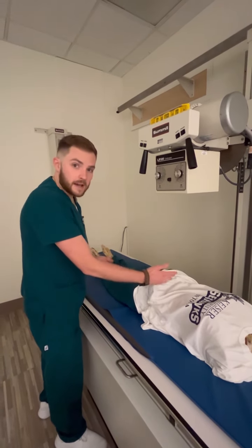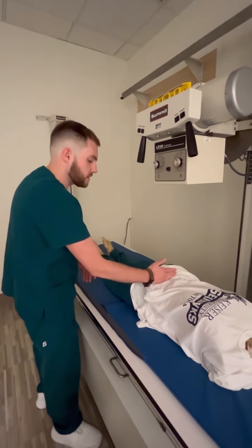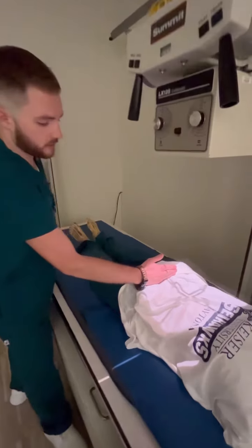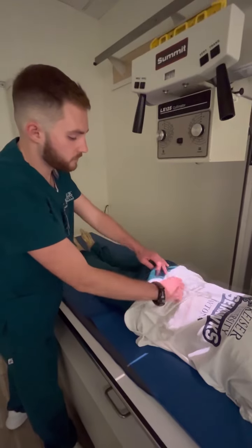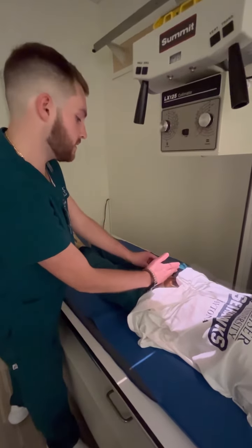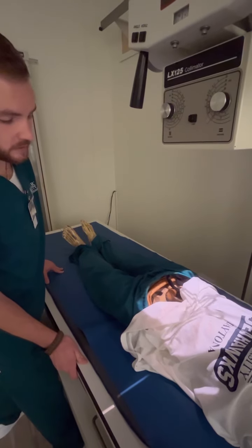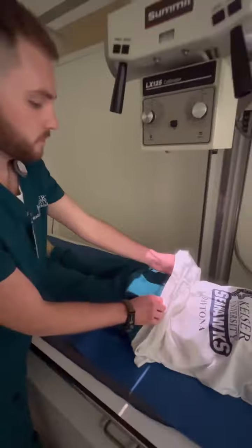Do you need to use the bathroom? Patient will say yes or no. If they say no, I'll just keep on going until I feel hard, which should be about right here, right about there. And Miss Pat is transparent, so I'm going to see if I'm correct. Yeah, about right here is where it's at. So I could actually bring her up just a little bit more to make sure I don't clip that. There we go. Okay.